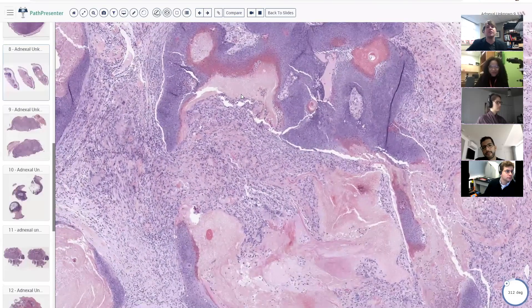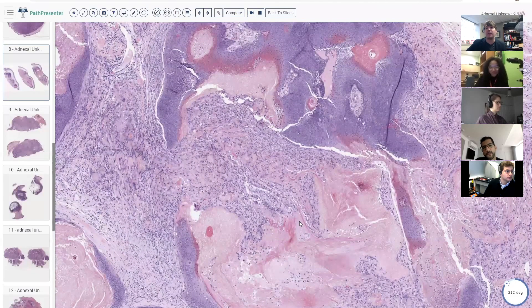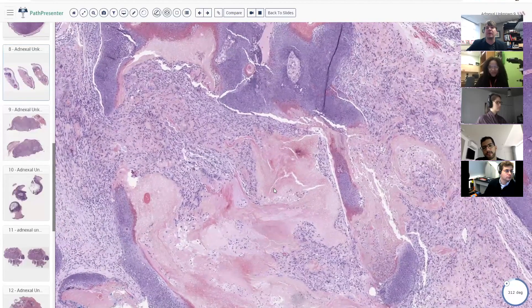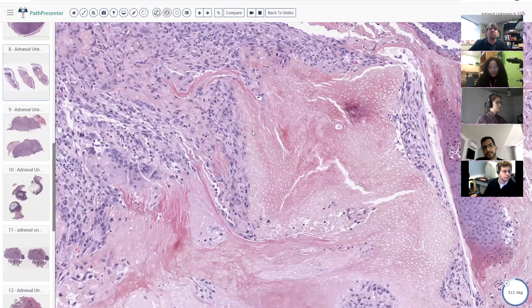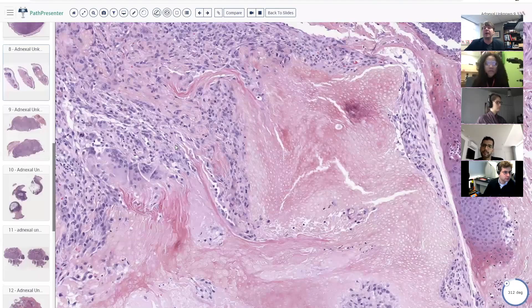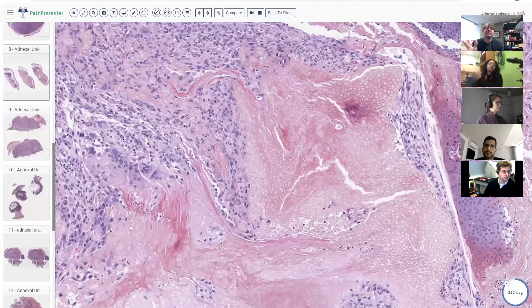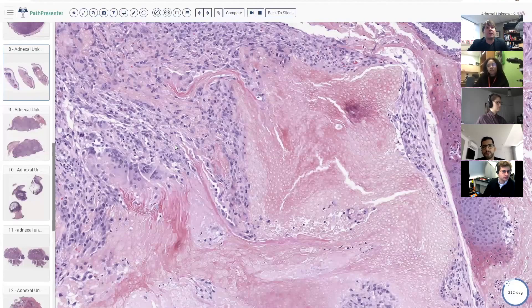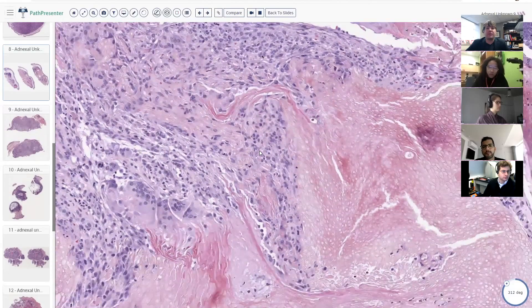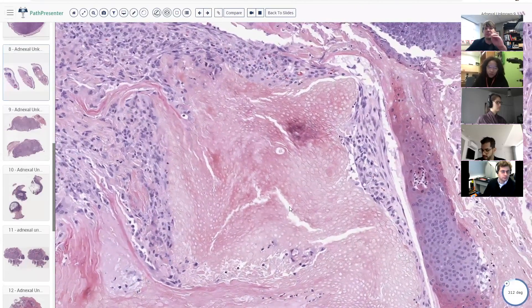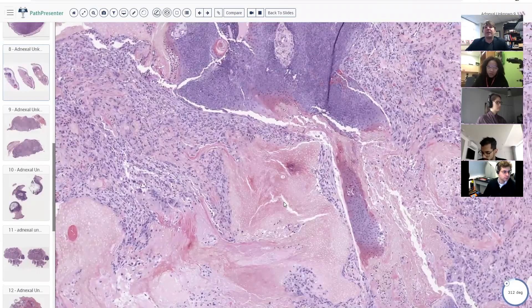To make a diagnosis of pilomatricoma: if I see a fragment of ghost cells with some reaction around it, I'm comfortable saying that's pilomatricoma. Sometimes on a biopsy that's all you'll get — a shave and just a little nip of ghost cells. You can say it's suggestive but may not be representative of the whole lesion. Finding these ghost cells and recognizing them is pretty helpful because sometimes you get just little fragments on a biopsy.